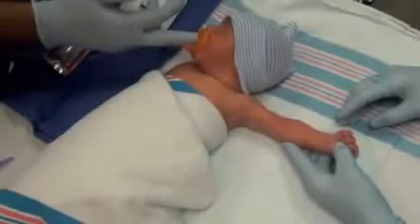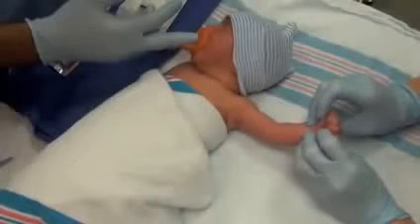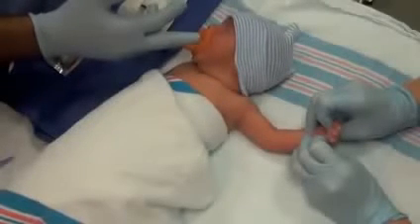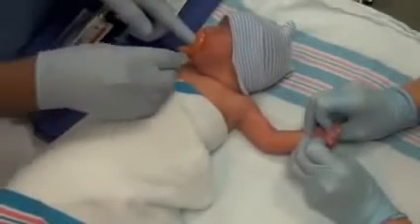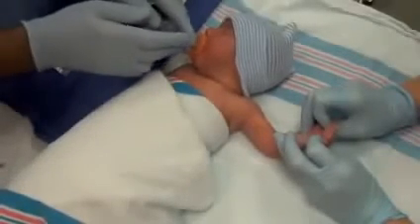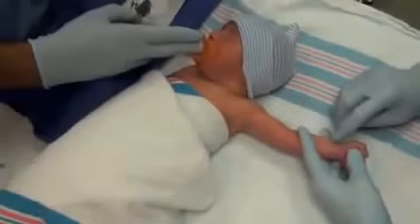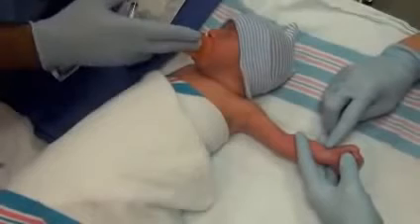The extremity must be assessed for collateral circulation by utilizing the Allen test prior to an arterial puncture. To perform the Allen test, elevate the infant's hand and simultaneously occlude the ulnar and radial arteries at the level of the wrist. The goal is to temporarily impede blood flow. The fingers may blanch because of the interrupted blood supply. Release the ulnar artery while occluding the radial artery and observe for color change. Do not puncture the artery if reperfusion exceeds 10 seconds. Delayed reperfusion indicates inadequate collateral circulation.